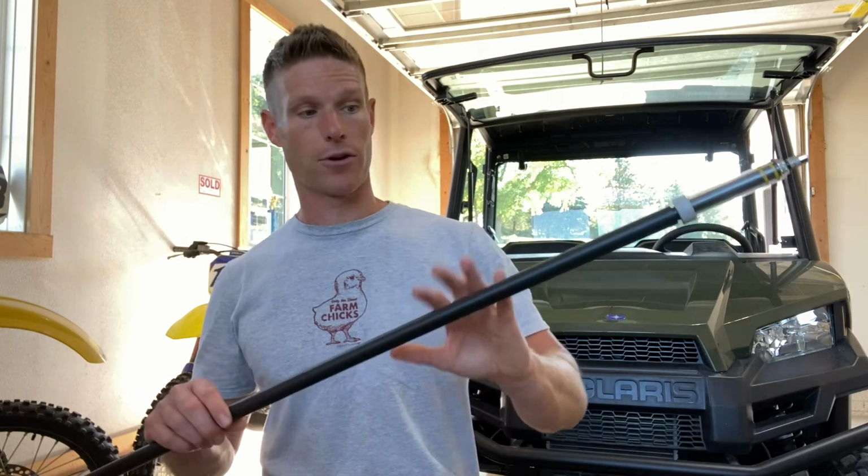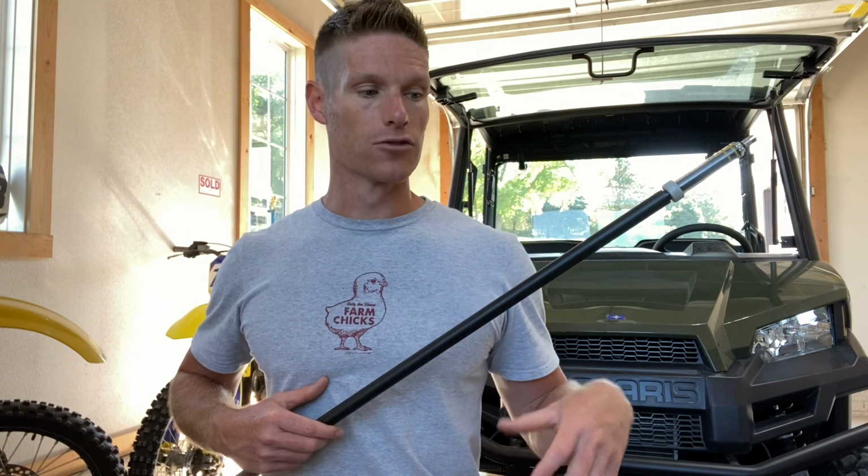I was using, again, I'm still using my cell phone to make these videos. It was on a chest mount. It wasn't pointed in the right direction, so you don't get to see everything. But basically what I did, because when I came back out there with this, he was still not wanting to let me get close. I basically took a handful of those step-in posts for my poly wire that are also black or white that he's used to seeing me carry around, bundles of those posts. And I hid this in that bundle of posts, and I walked out with some of those protein cubes. So I put those down in a pile to kind of distract him, and then I walked out with a bundle of posts, and you'll see in the video, I dropped those posts real quick. I had one shot. I turned around and I jammed this thing into his rump.